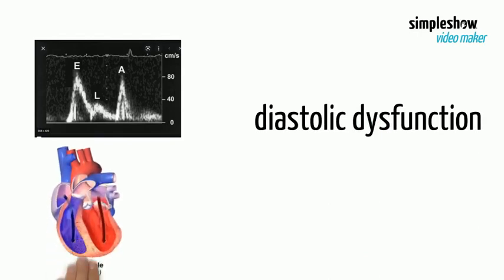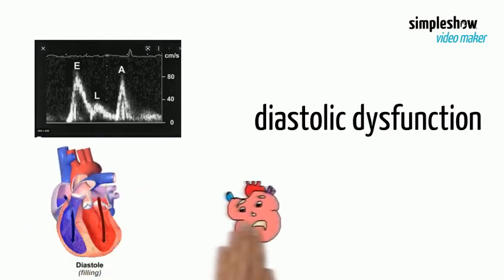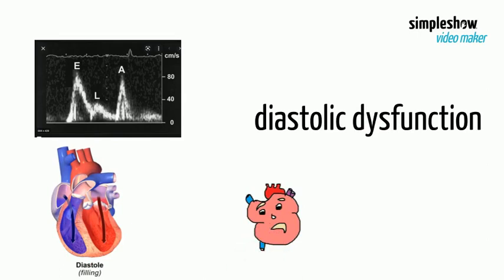Diastolic dysfunction with impaired LV relaxation develops early in most cardiac diseases and can progress to include increased LV stiffness, which leads to the elevation of LV filling pressures. Echocardiographic measurements of diastolic function reflect tissue changes and therefore provide important prognostic information.